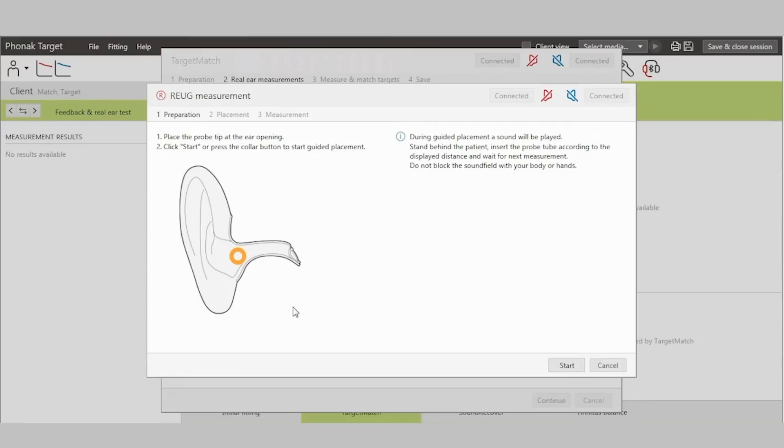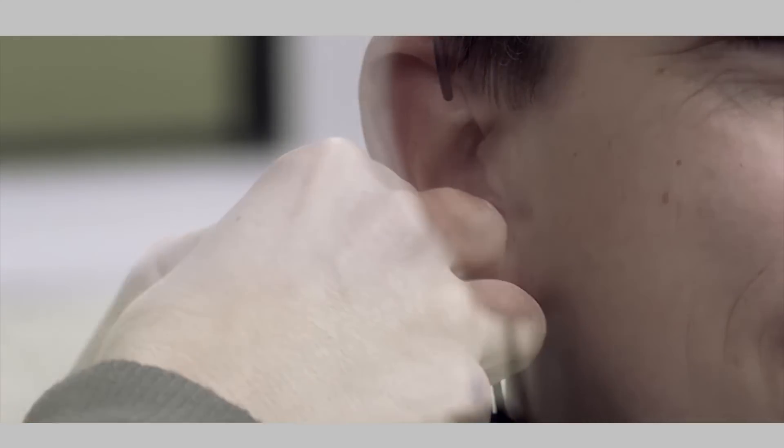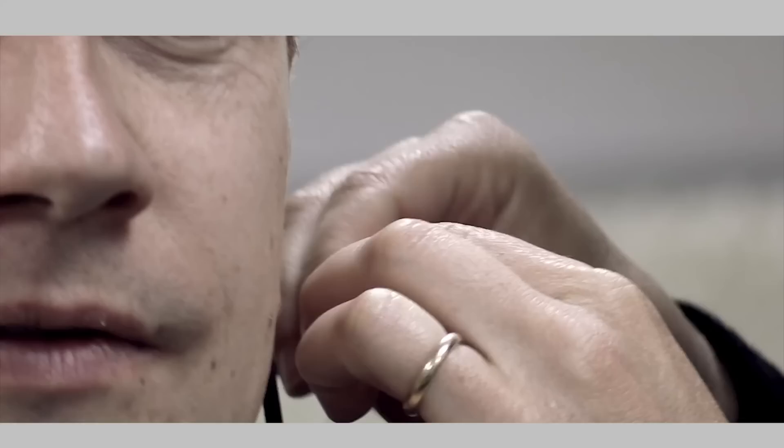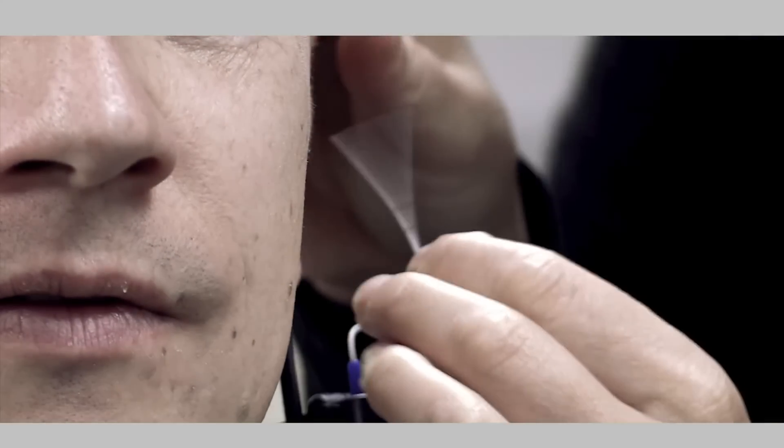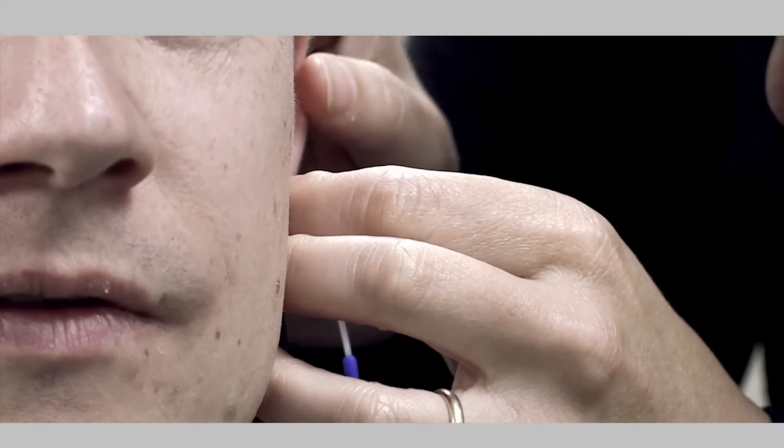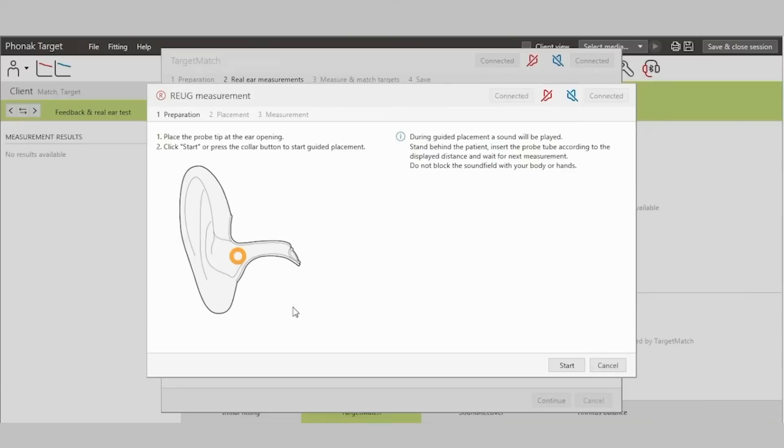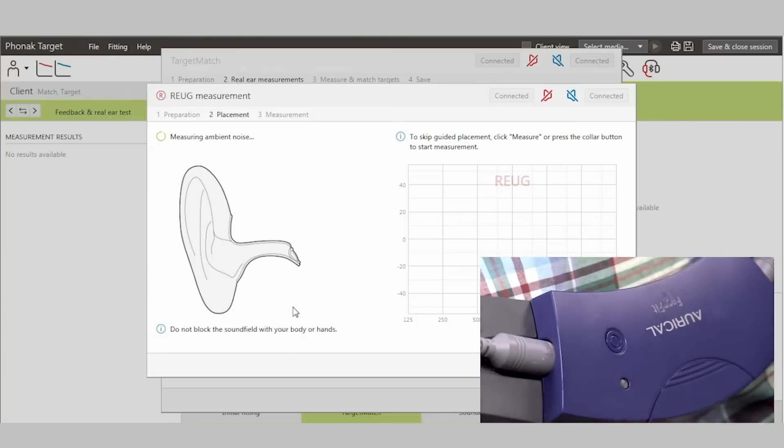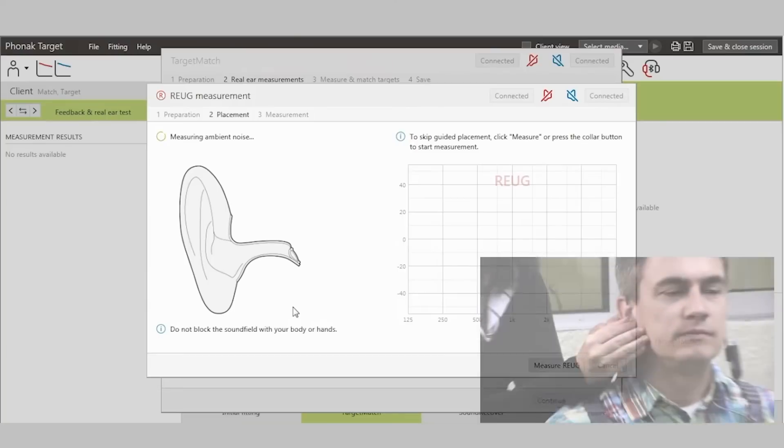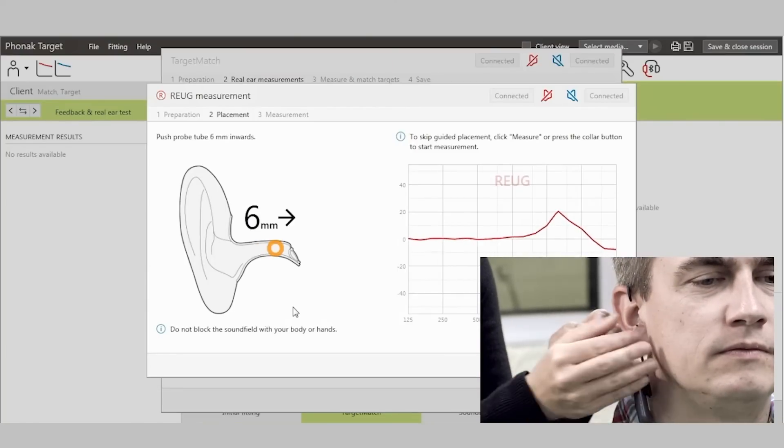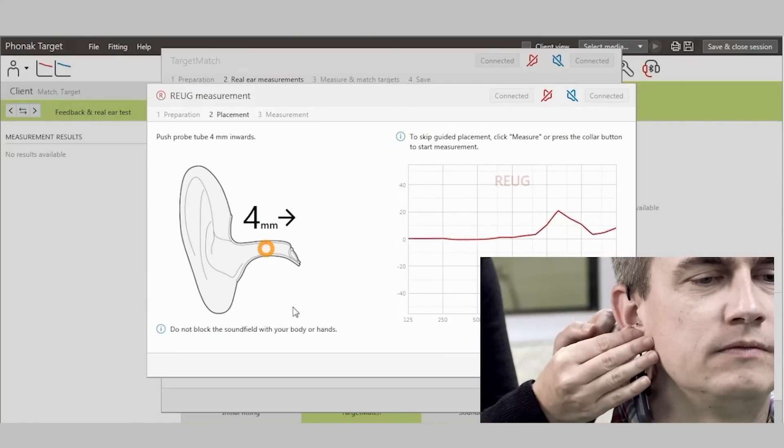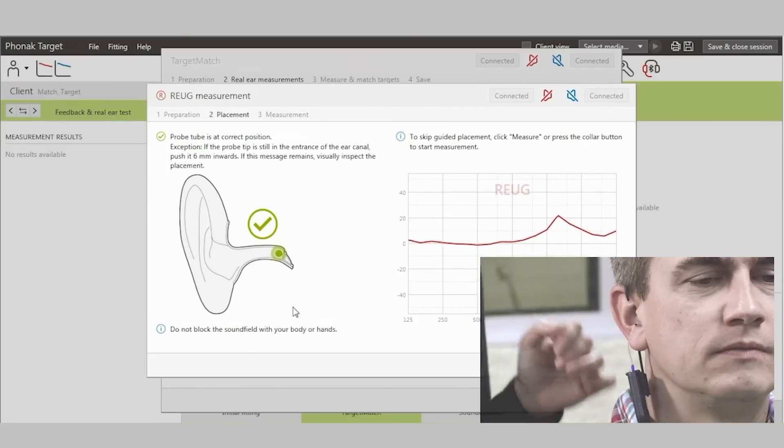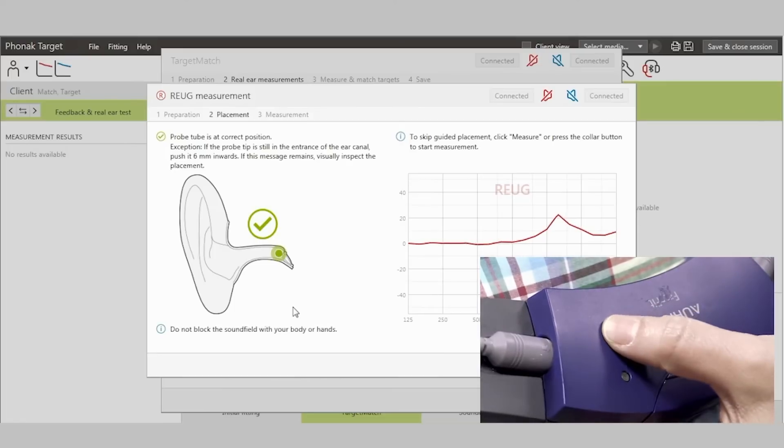To activate this functionality, press either Start on the screen or via the button on the collar of the FreeFit. Once activated, you will see whether the probe tube needs to be moved inward or outward. Let's place the probe tubes into the ear. The distance to the optimal position is shown in millimeters until a green checkmark appears. I can now perform the REUG measurement by selecting Measure REUG or pressing the collar on the FreeFit.